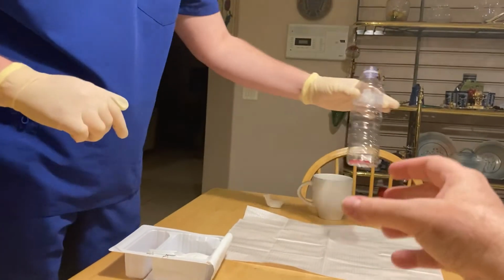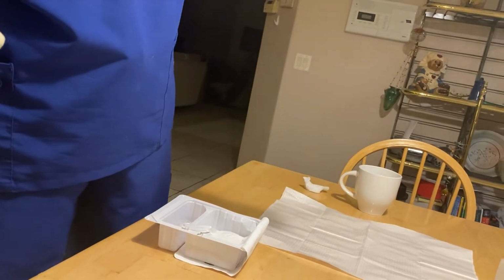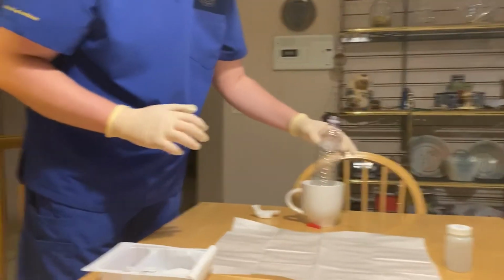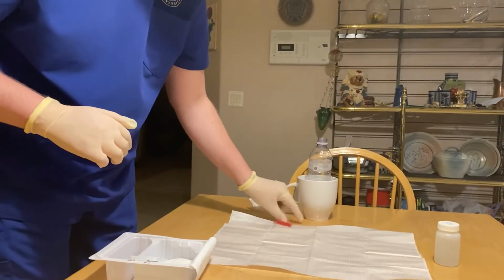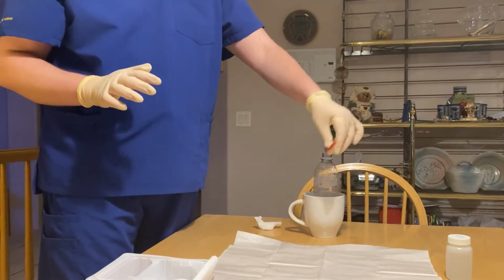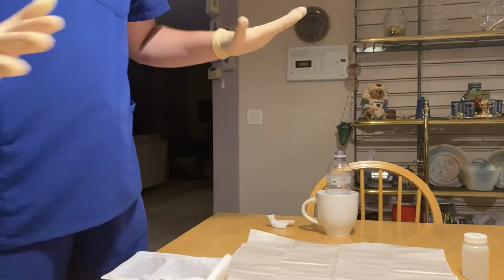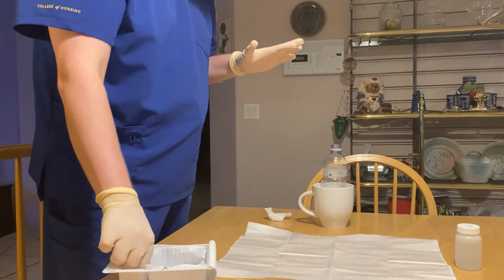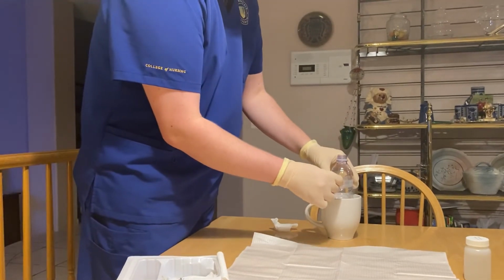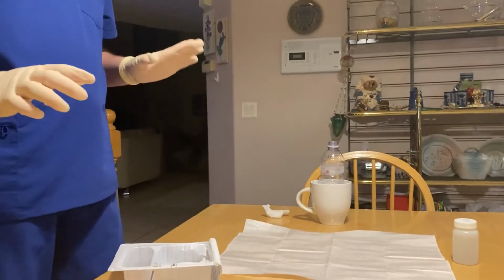I'm going to have my assistant here fix that for me so I don't have to do this again. Okay, so fixed. The red thing normally does not want to stay in. But what I would normally do, I would use my dirty hand to remove it, and then I would throw that away. And then with my clean hand, I would take the other one that I have inside my trach kit, and I would put it back in.